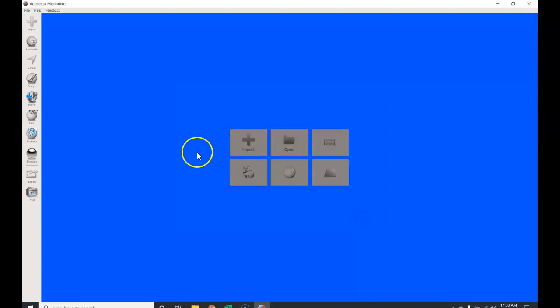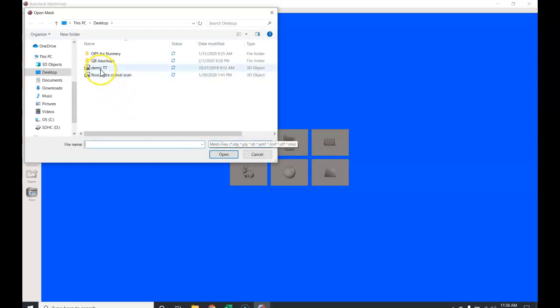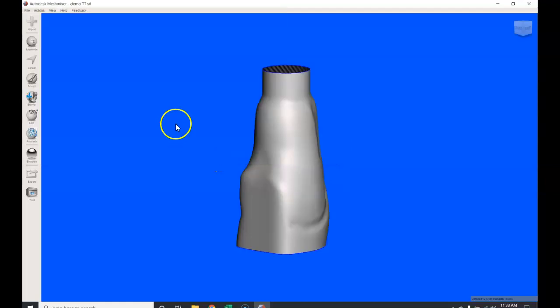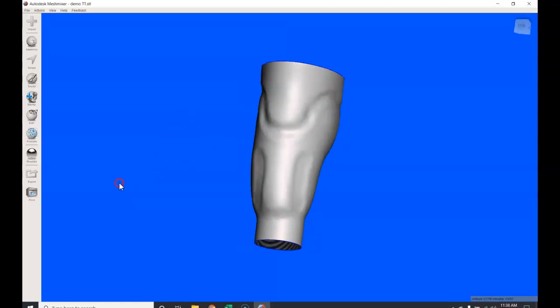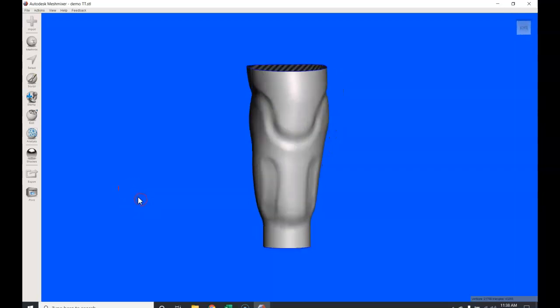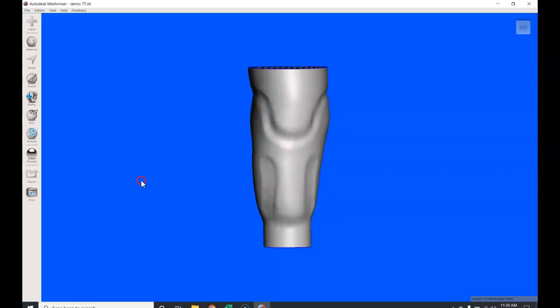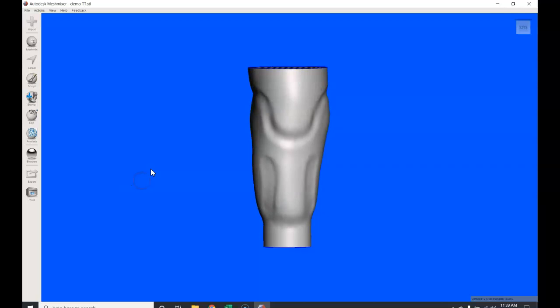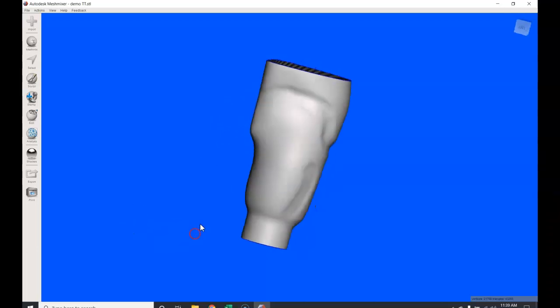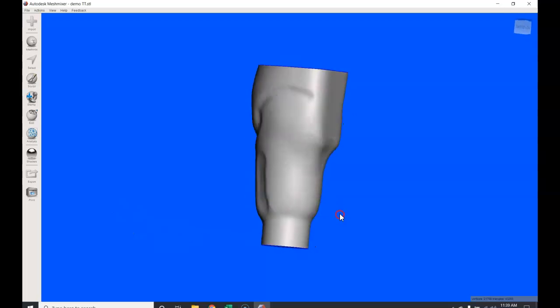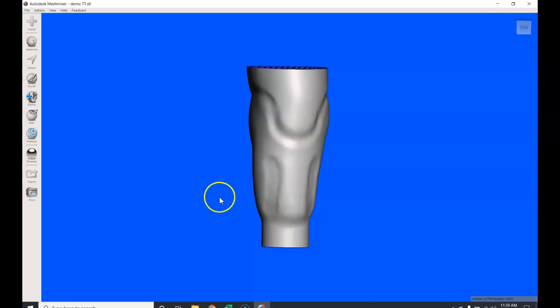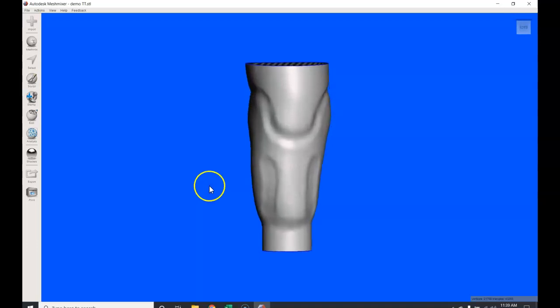Now we're going to import our file. I have a file demo transtibial. This file was scanned and modified utilizing Willowwood's Tracer program. This was a direct scan to a patient with a right transtibial amputation, and this was done over a custom gel liner. We went through the modifying process through Tracer; you can see my modification designs. I've also extended the distal end for a cylindrical adapter which I'll be using a bulldog lock.